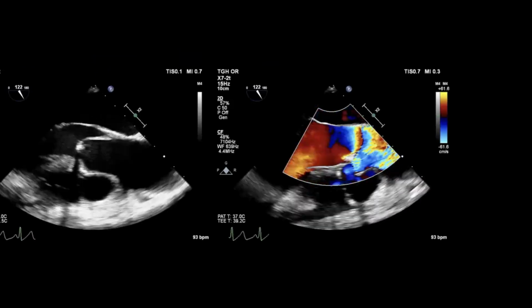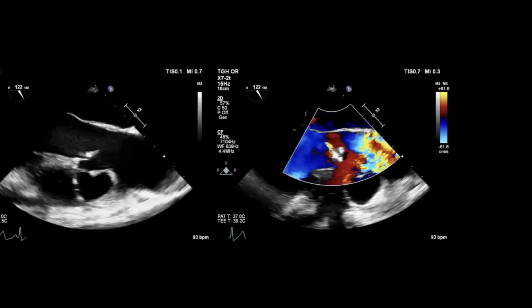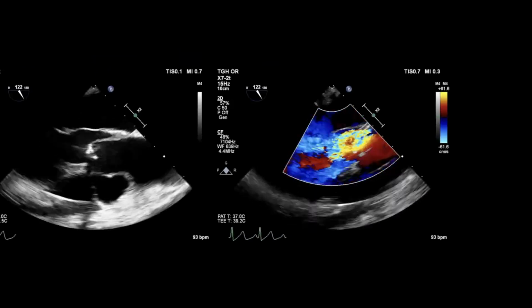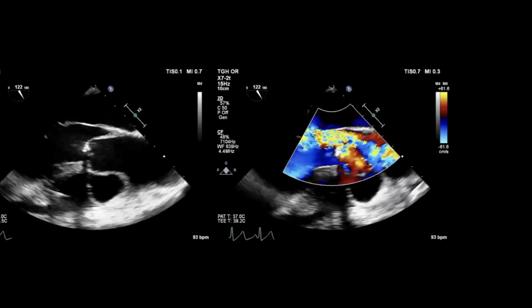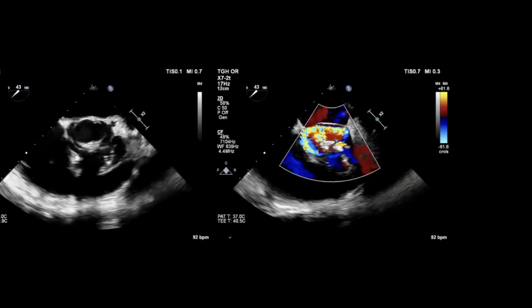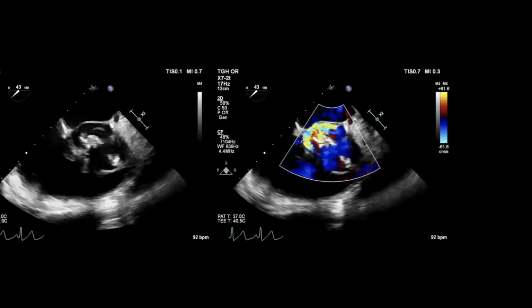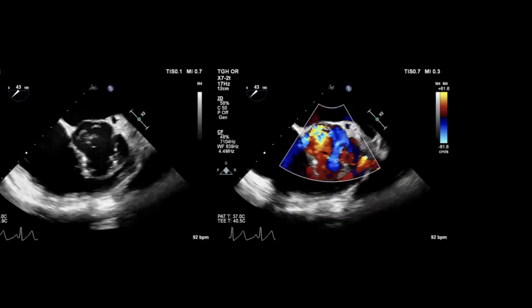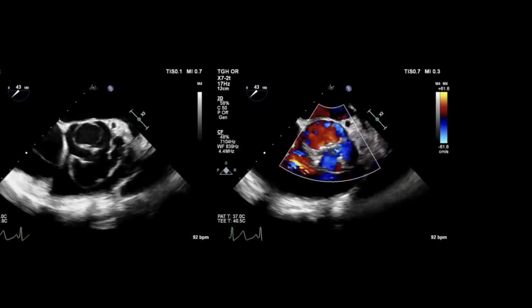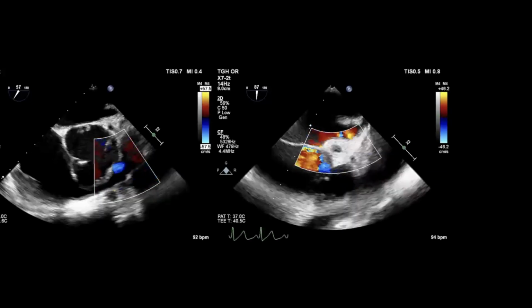And this is an intraoperative TEE, so from anesthesia. Again, we see that mass on the bicuspid aortic valve, that posterior split, and the color flow is very concerning. Is it prolapse? It's kind of interesting morphology even in diastole. Yeah, there is something funny about the leaflets during that. It's more redundant. With bicuspid, you really see the masses a lot.